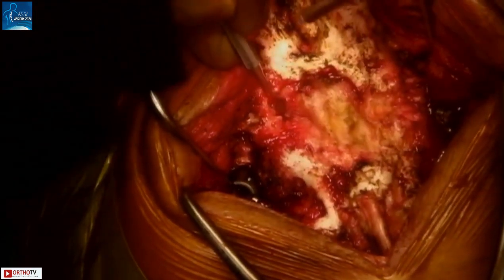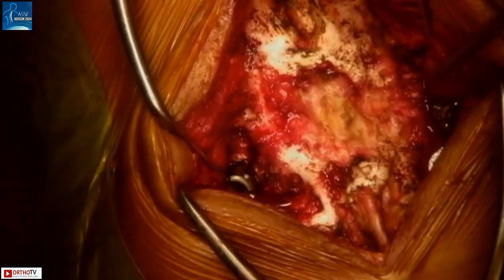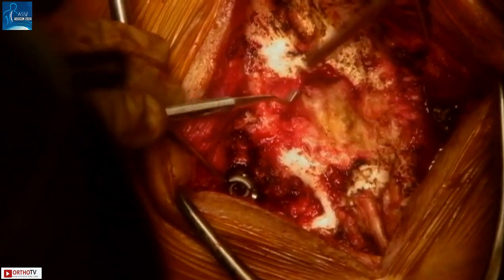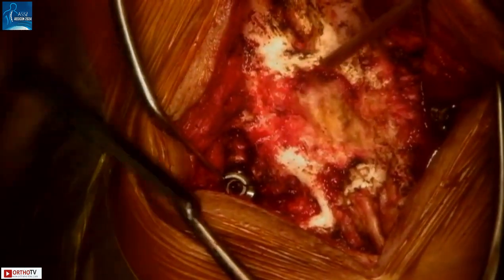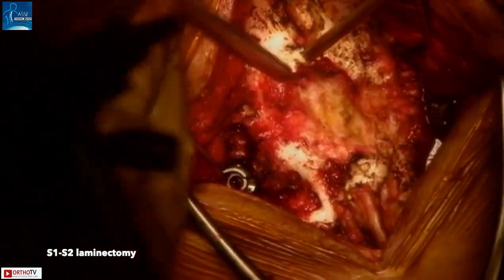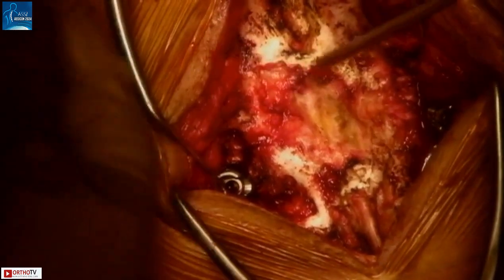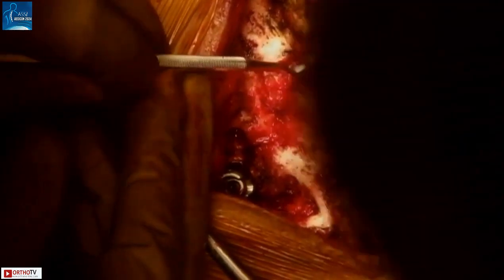Here I am identifying the S1 pedicle, which is my landmark. The S1 nerve root is right below, and I am going to extend the laminectomy caudally. We continue to take down bone, confirm that the root is free, and dissect off all adhesions — this is extremely important so as not to injure the dura. The video has been sped up to show the laminectomy. As you go further caudally, the lower extent of the laminectomy should be around the S2 level. You should be able to see the shoulder of the S2 nerve root adequately to initiate the trajectory for the trans-sacral fibula.